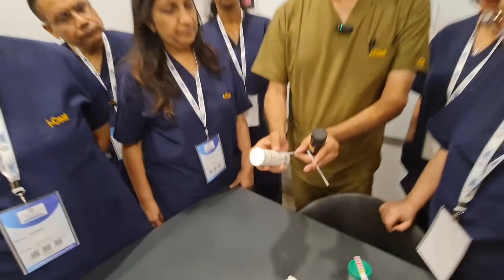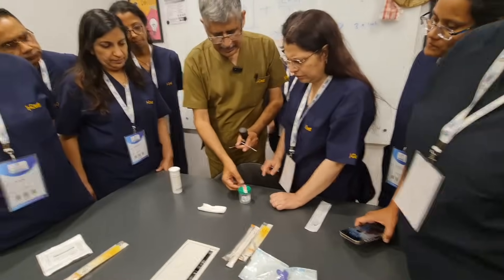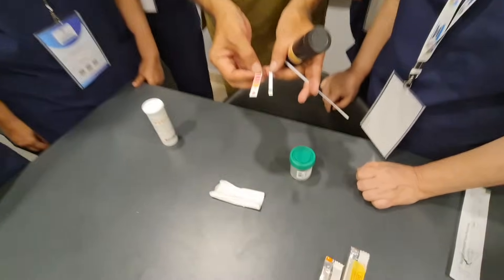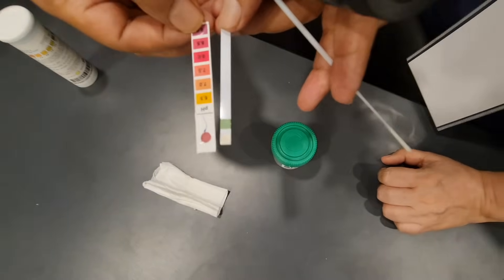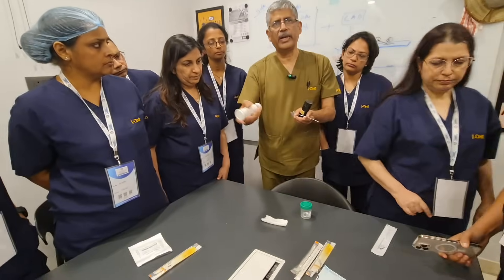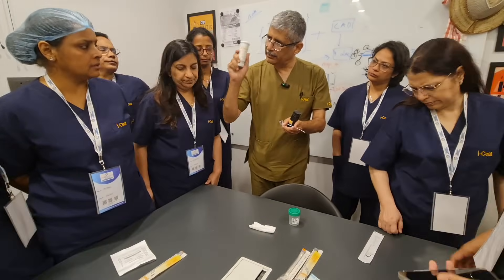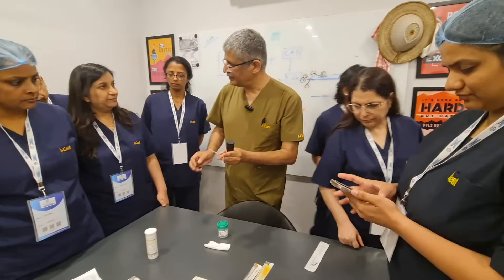We are sure that the pH is around 7.5 to 8 on one strip, and around 8 to 8.5 on the other. So there are multiple ways to check. The advantage of the combination strip is that we can look at the WBC as well as the pH. Fantastic — done.